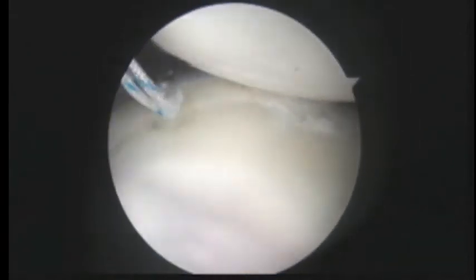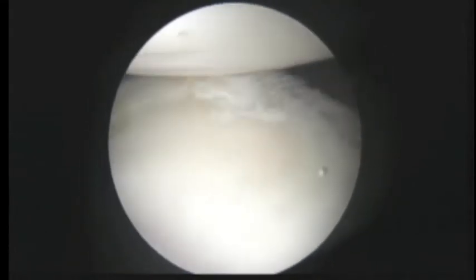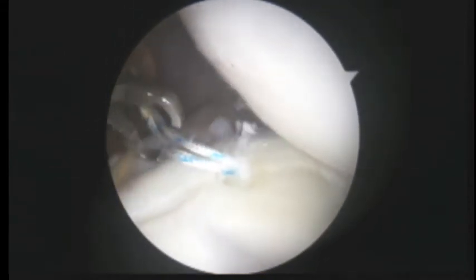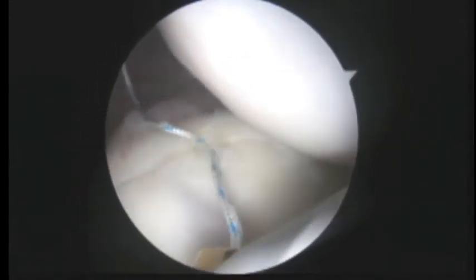I need a pincher tool. Take this suture and pass it off to the front here like that. Okay, and then we'll take that instrument called a rasp, and we'll use this coming through the yellow cannula just to help roughen up the capsule a little bit. See, it has these sharp points on it.